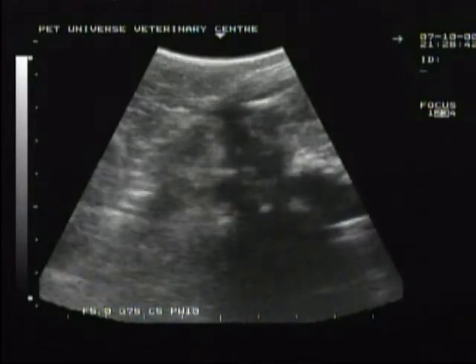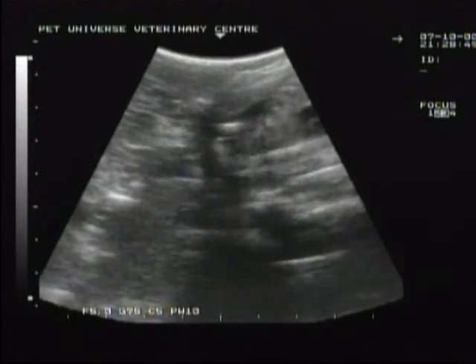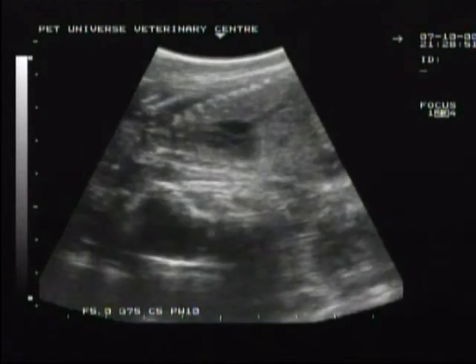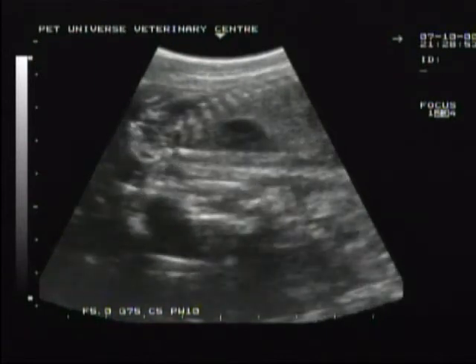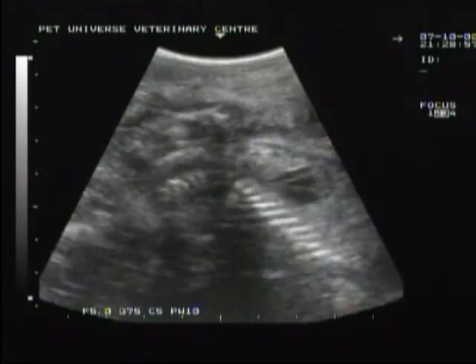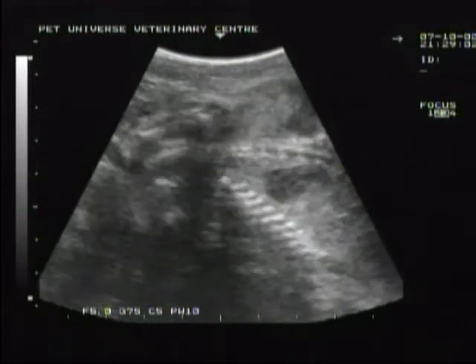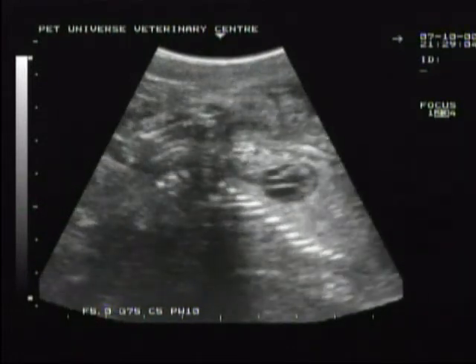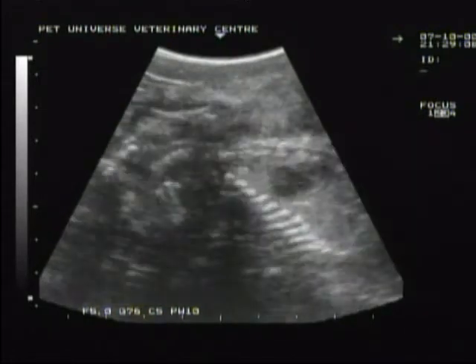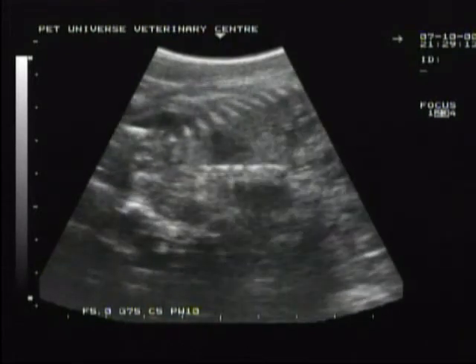Towards the end of pregnancy, what we get a bit more is perhaps some more obvious heartbeats. So we try to zoom into the heartbeats to make sure that the babies are alive. There's one at the top there, you can see the ribs, and that's the chest, and the black part in the middle is actually the heart. And there's another one, so there's 2 of them side to side here. There's one here, and it's beating really, really well, very rapid beats. And we'll try to zoom into the other one just next to it. There you go, you can see the other one coming into view now, and it's beating away happily as well.